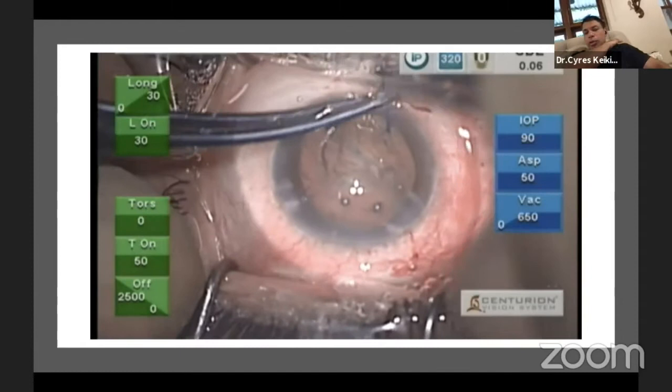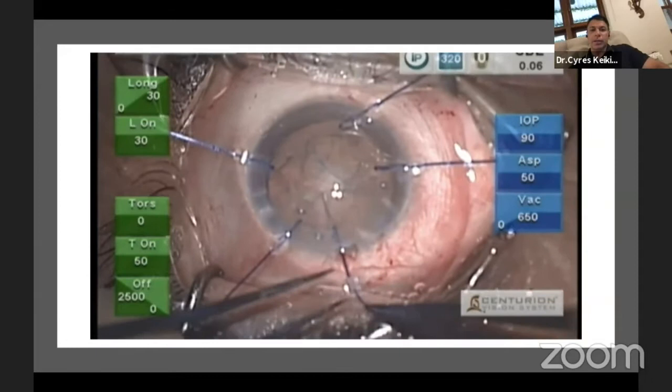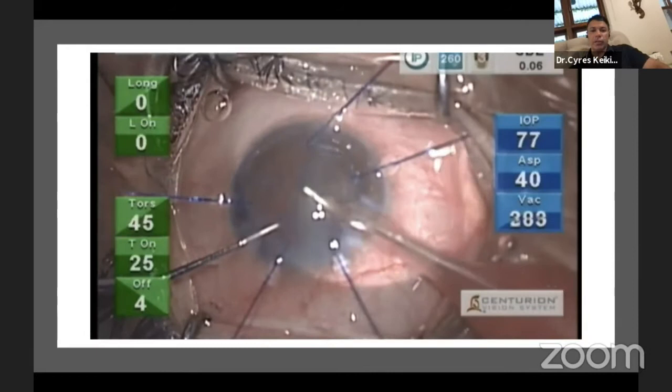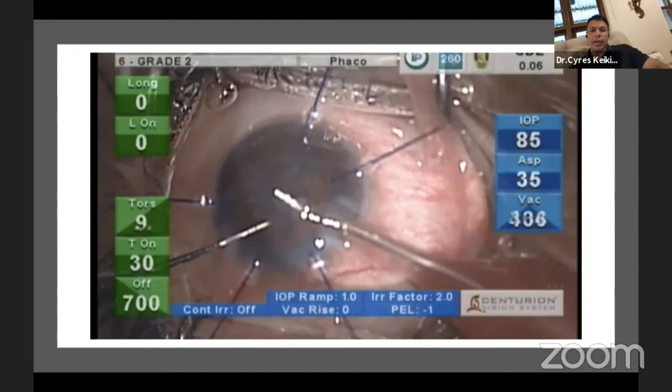Remember that with pupil hooks you use five hooks, not four. We want pupil hooks in this case — not capsule hooks — because they are much smaller, more manageable, and easily available. We put in five pupil hooks and proceed with emulsification of the nuclear material. Once the bag is held by the pupil hooks it's rock steady.